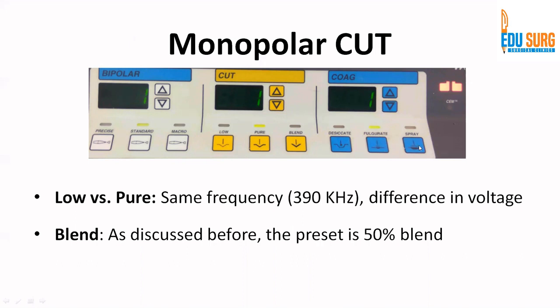If you have assisted some cholecystectomies laparoscopically or open, you would see that the spray setting is used for performing hemostasis on the liver bed after removing the gallbladder. Very commonly used site for spray. Another commonly used site for spray is retroperitoneum. We will see why the spray mode is used in these areas, what is unique about this spray mode.